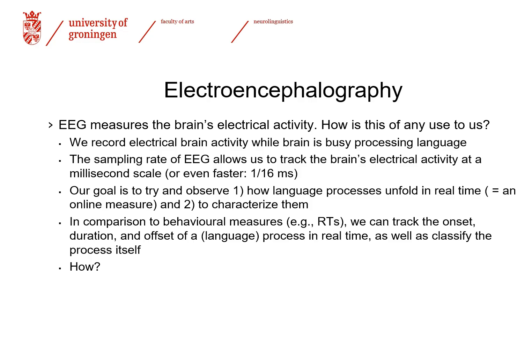So this can be at the level of milliseconds, and with the newest equipment, at least with the equipment that we have, we could get a new data point at 1/16 of a millisecond. This is so fast that we actually do not even record at this rate. We get a data point normally at the millisecond rate or even slower than that.